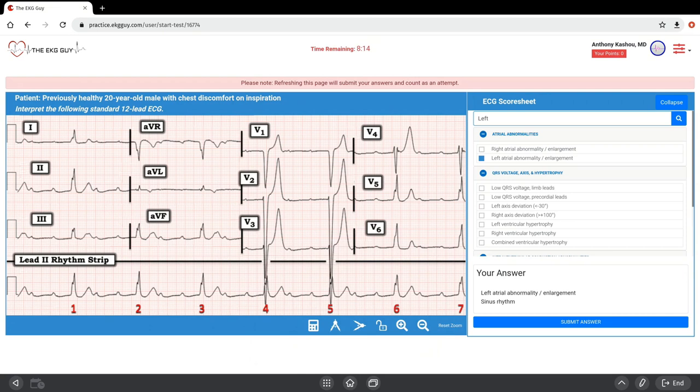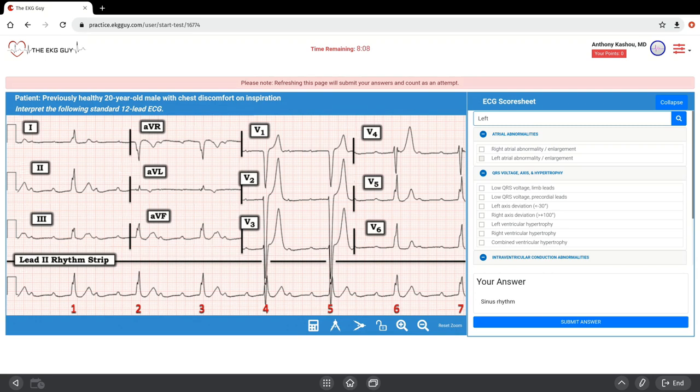Click that and it shows up. Once you're done, submit your answer, and then we'll go through this ECG together.